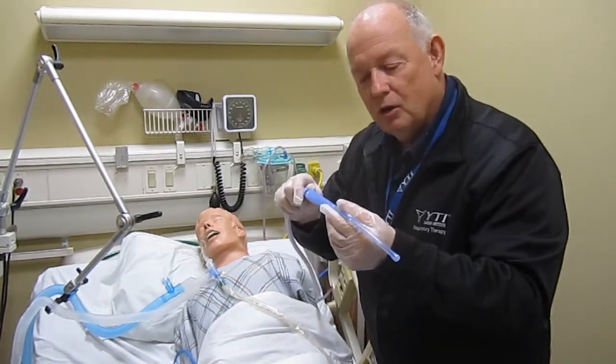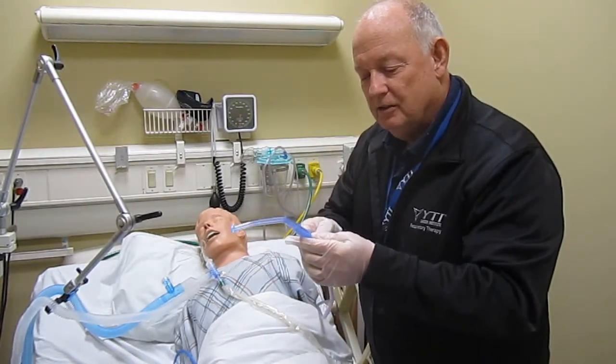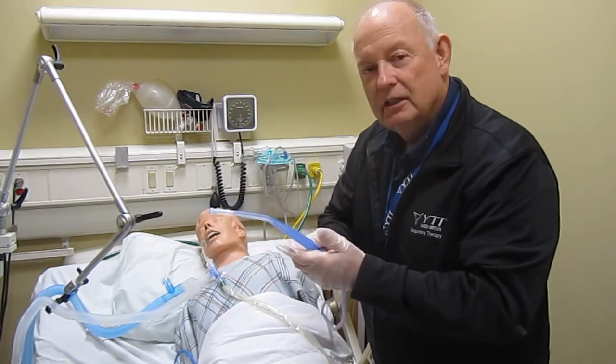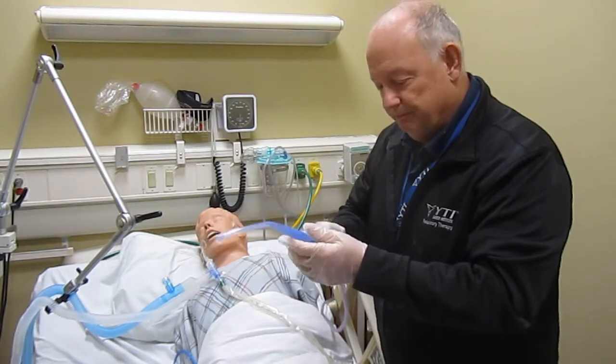This one has no device on it to regulate the suction. Some have a little hole that you can close to apply the suction. This one doesn't.